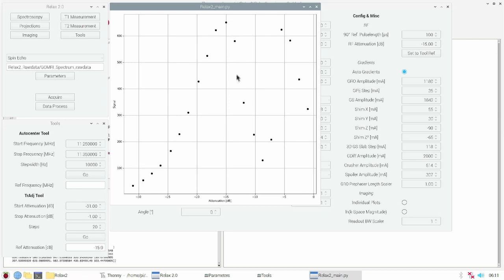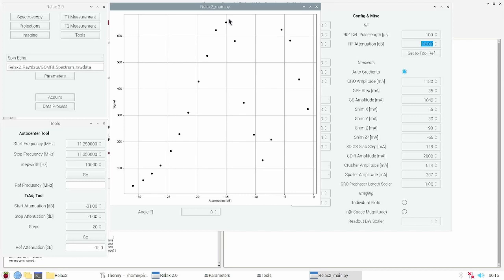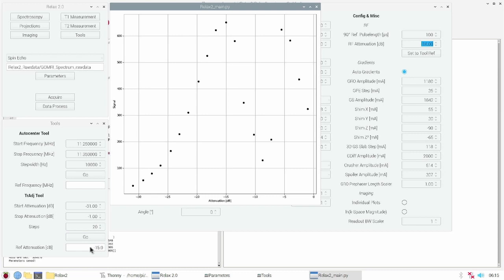After that we flip further to 180 degrees where we get to the first minima, then we get 270 degrees and 360 degrees. We have to look for the first maxima which is the 90 180 degree condition, which has minus 15 dB of RF attenuation. This is also the result of the transmit adjust tool. In the parameter window we now can set the RF attenuation to the tool reference.